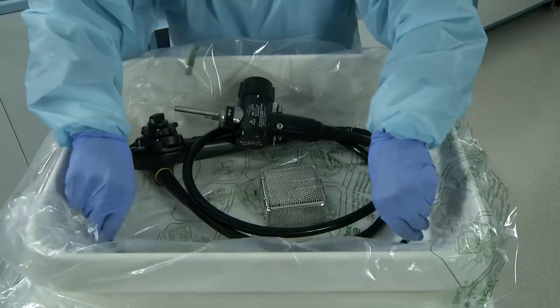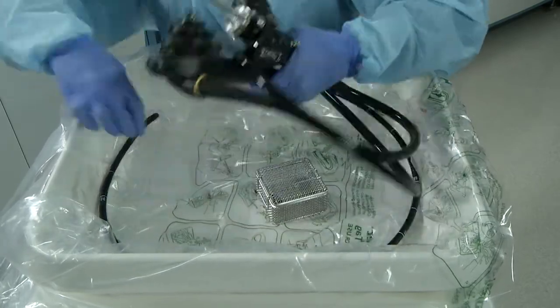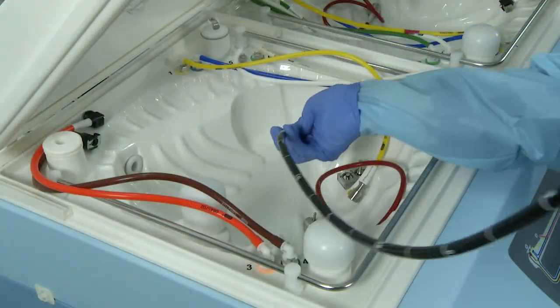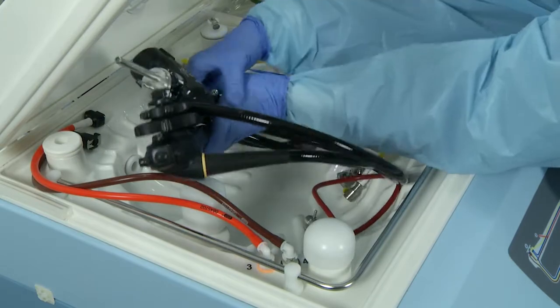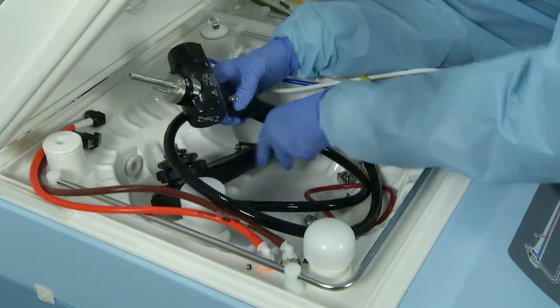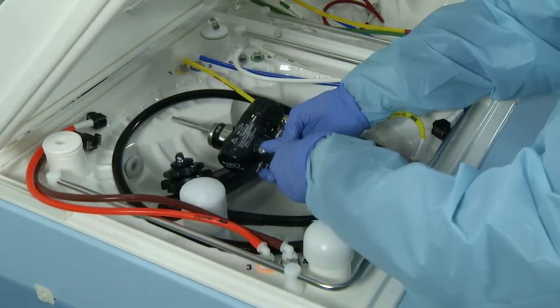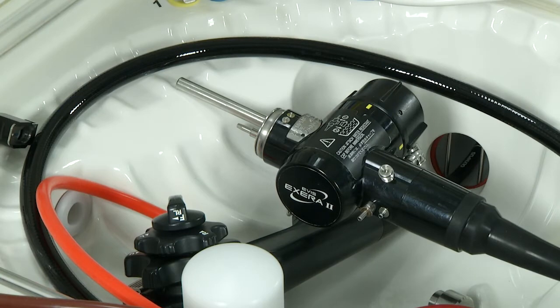For proper handling and loading of an endoscope, hold the distal end of the endoscope in one hand and the umbilicus loosely coiled in the other. Guide the insertion tube gently through the 2 metal bars that lead to the helical tubing in the basin. Position the endoscope head in the basin so that the umbilicus is loosely coiled and resting on the basin edge. The head of the scope should be gently placed with the knobs facing up to prevent unnecessary stress.